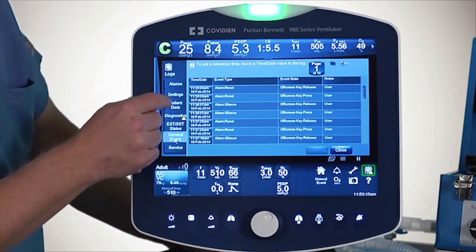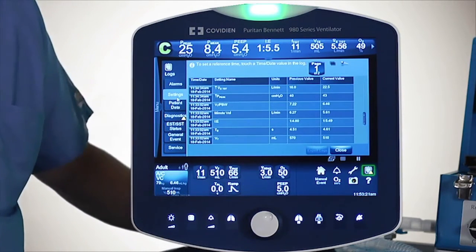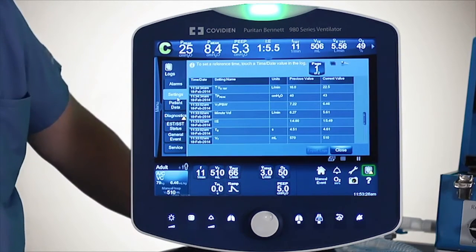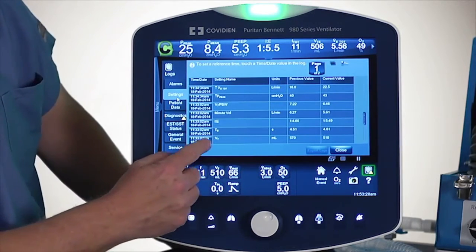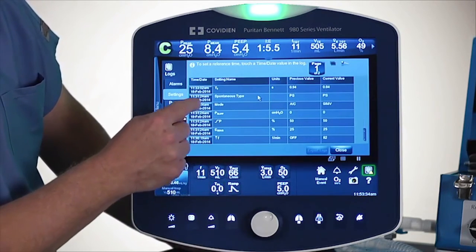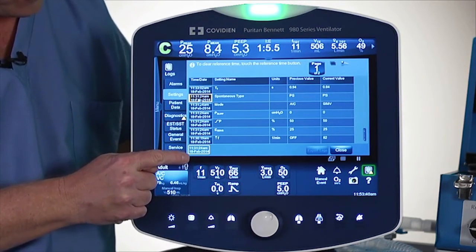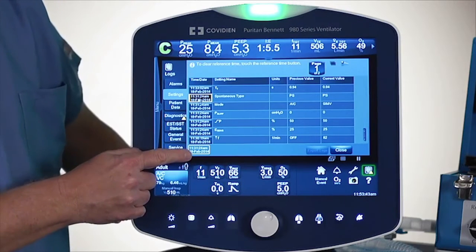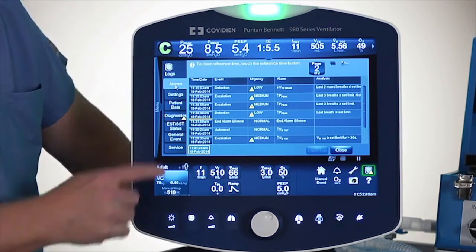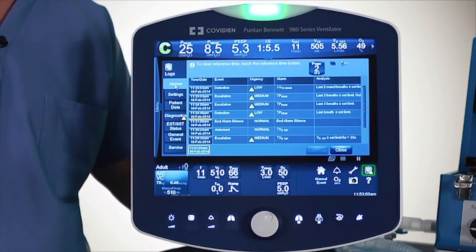Let's say there was something you wanted to investigate. You go under a certain setting, someone changed it, and you're wondering what happened with alarms around that setting change, or maybe what happened with the patient data information. So I can pick a specific setting change — I'll pick one here, touch that button, and it pulls it down to the lower part of the screen. If I hit the log tab now, it draws a yellow line and lets me know what the alarms were before and after that setting change.